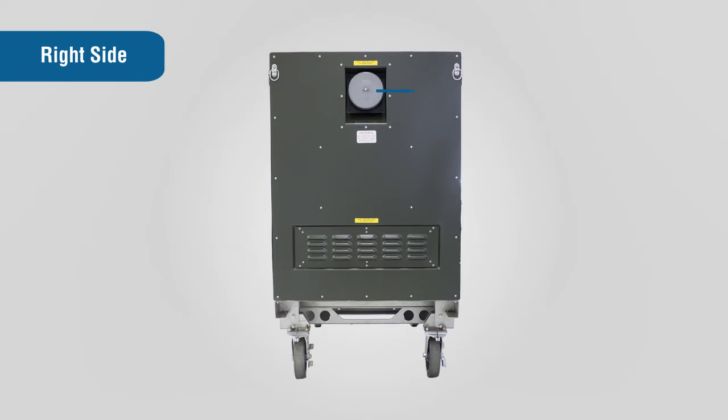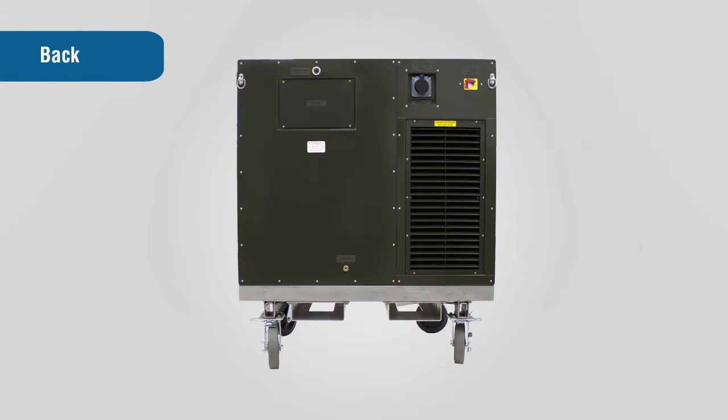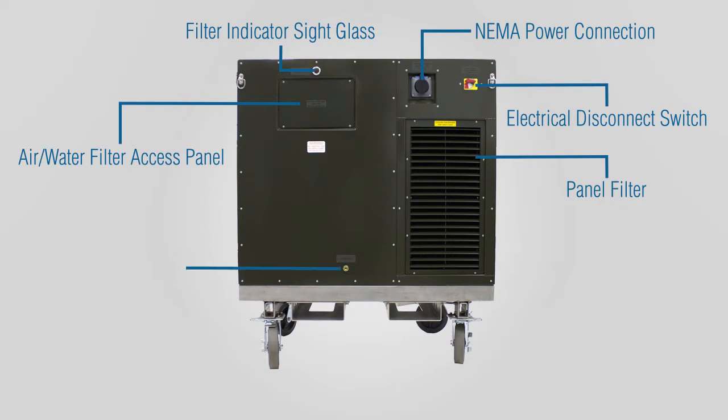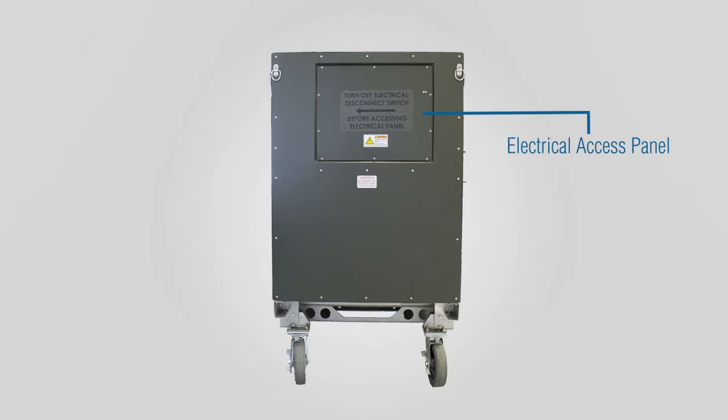The right side of the unit has an intake air filter and a louvered panel filter. Located on the back of the OGL are the following: the air water filter access panel, filter indicator sight glass, NEMA power connection, electrical disconnect switch, panel filter, and the water drain port. On the left side of the unit, you will find the electrical access panel.